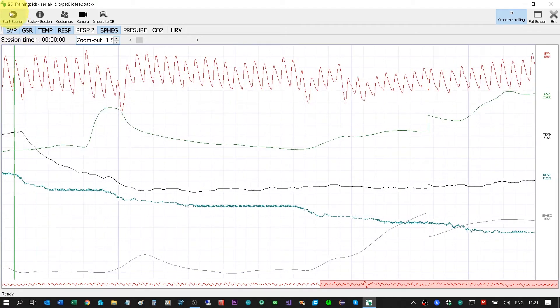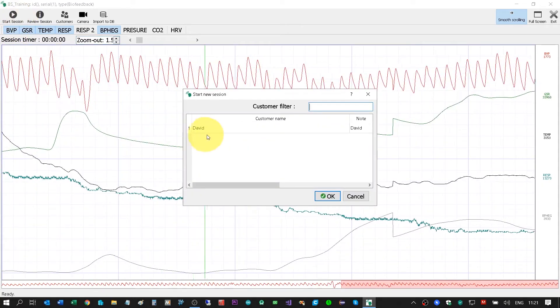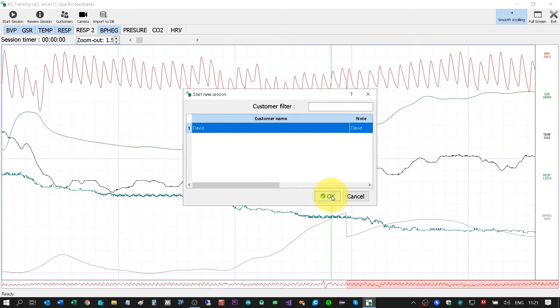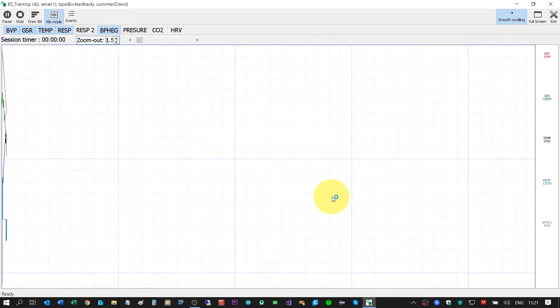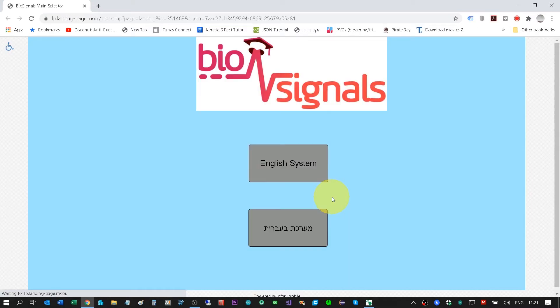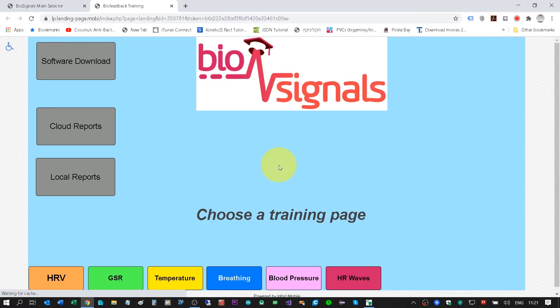I will click on Start Session, then choose the name of the customer and click OK. At this moment I already start to record and read signals from the hardware as a training. I have a selection screen — I will click on English System, and I can see different buttons for each of the different trainings.